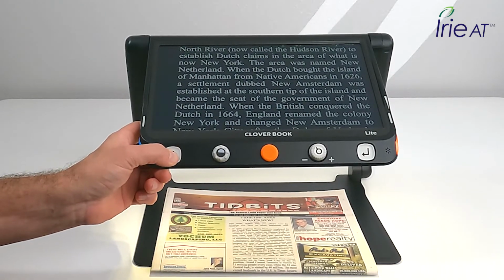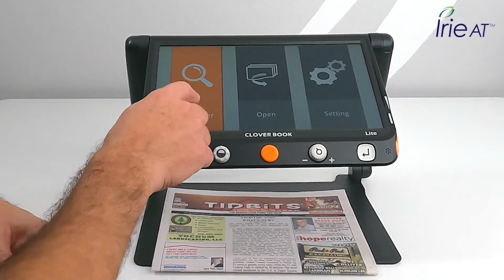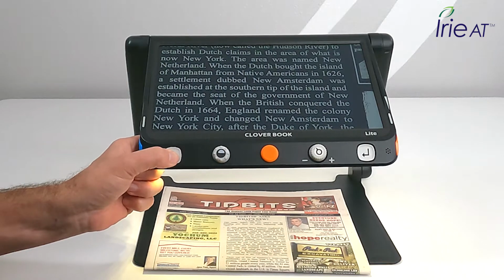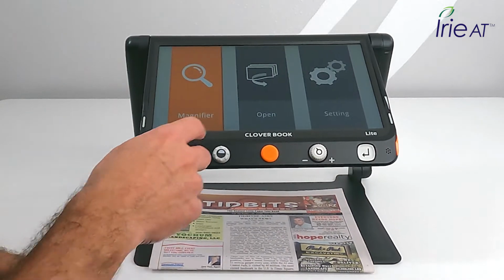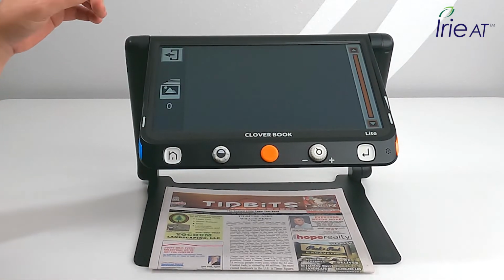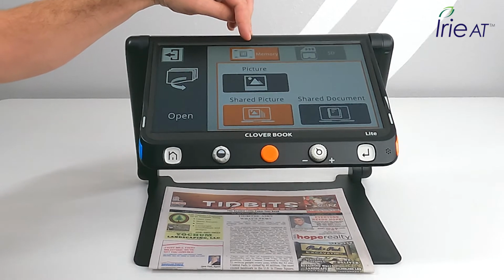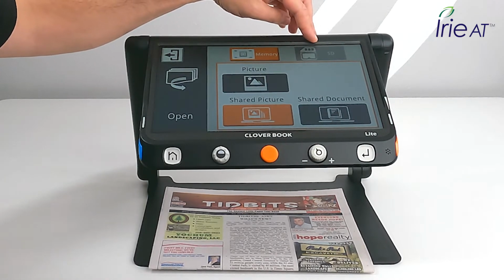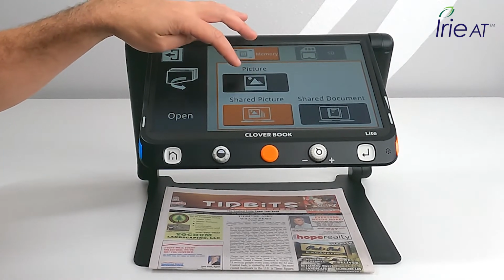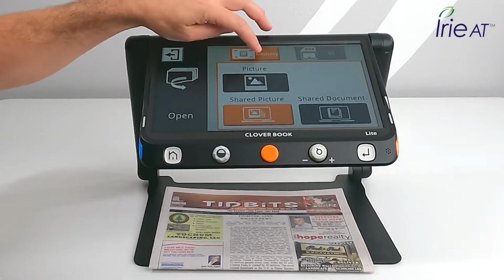Now I can hold down the home button, and it'll give me my main menu. So I was already in Magnifier, that's your default. Magnifier, near view. Touch Magnifier and I'm in my Magnifier. I'm going to long press it again, get back in there. And in here, I can go to Open. Open. Shared picture. I'll choose that. And I have a choice in here to use the memory that's on the device, which I think you get a couple gigs on there, or I can put in an SD card and I have tons and tons of gigs of storage. You can share those, you can pull them in and out, move them around in here. And I'm going to go into the memory here.